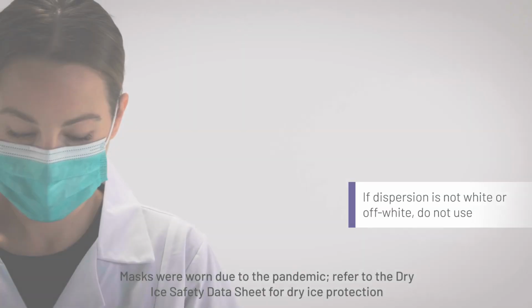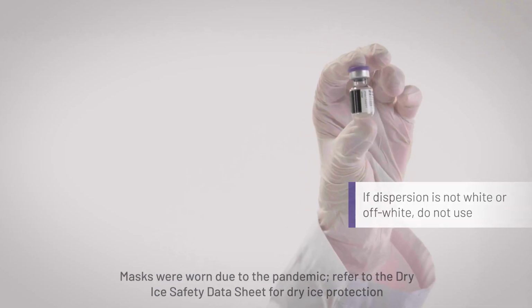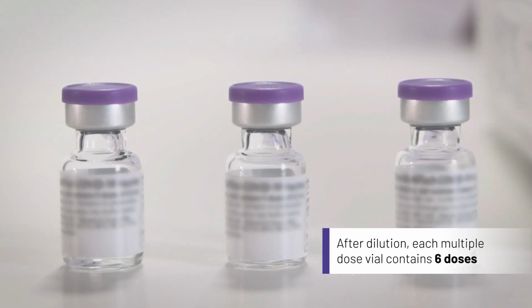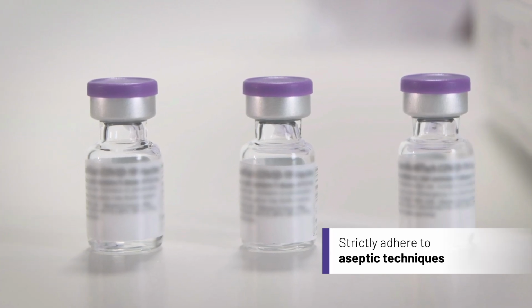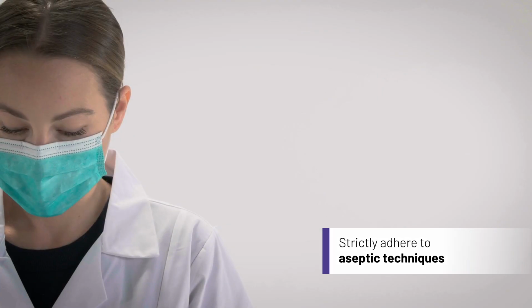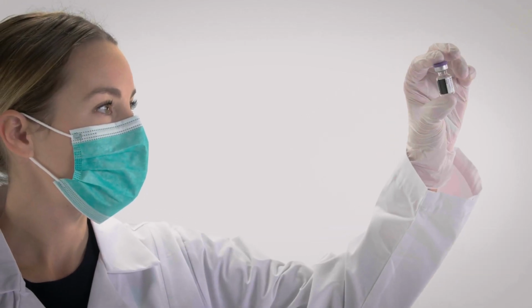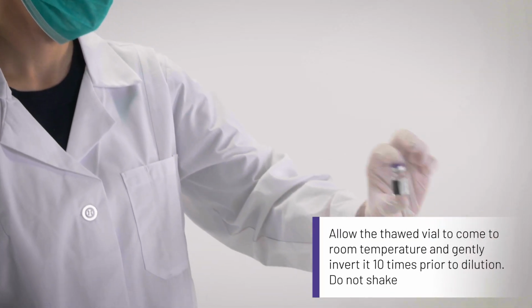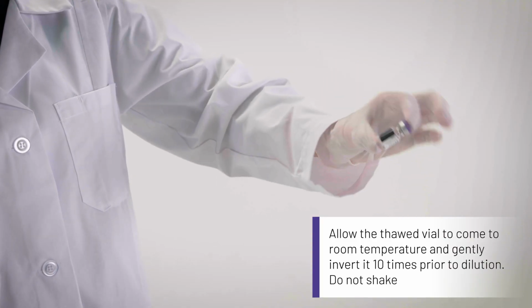Prior to dilution, the thawed dispersion may contain white to off-white opaque amorphous particles. The multiple dose vial contains 6 doses of 0.3 milliliter of vaccine after dilution. Strict adherence to aseptic technique must be followed. After thawing and prior to dilution, ensure the vial is at room temperature and not cold when touched. Invert gently 10 times to mix. Do not shake.